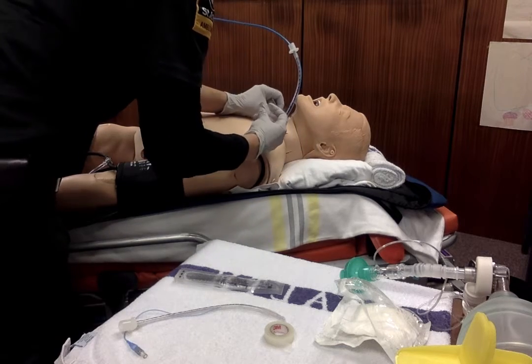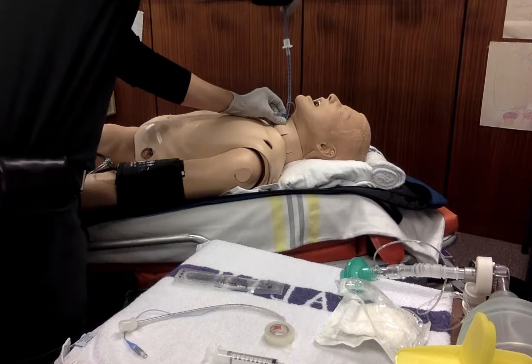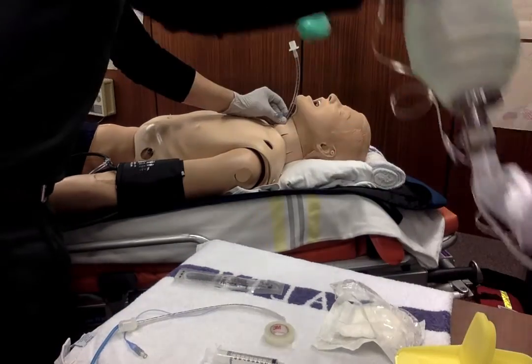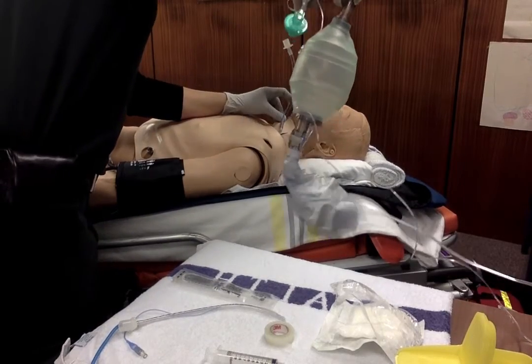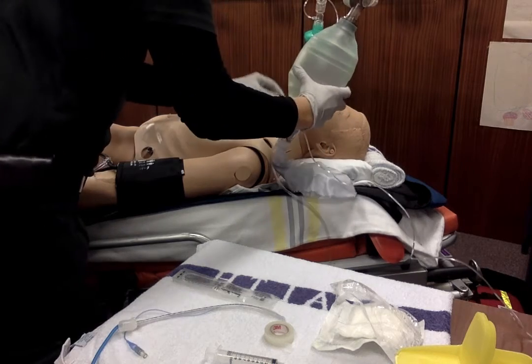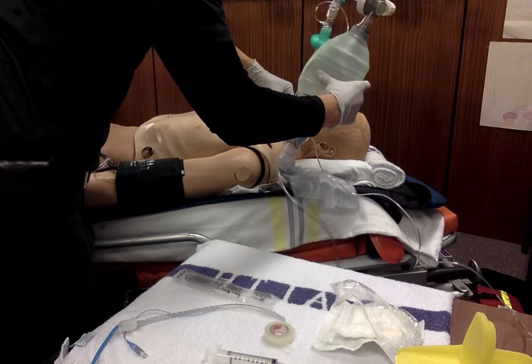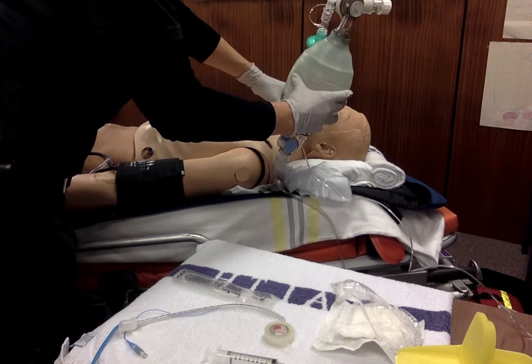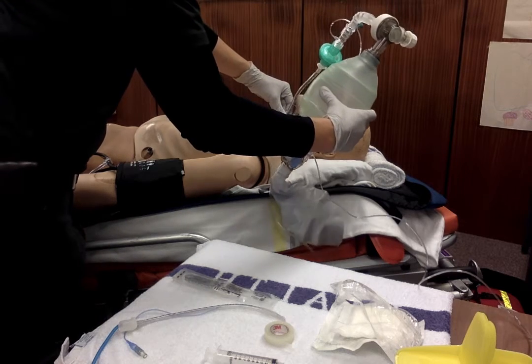I'm going to inflate the cuff first and remove the syringe before I remove the bougie. Again, if I have an assistant, would be great. Attach, try not to let it get dislodged. And I'm going to look for some chest rise and fall to see if it's even. I've also got my capnography plugged in, so I'm going to have a look over at my monitor and check what that's doing.